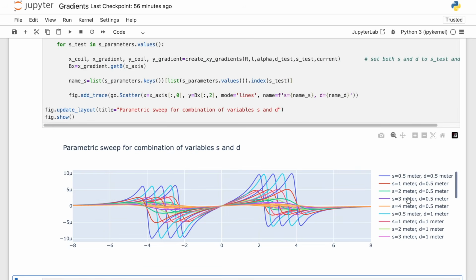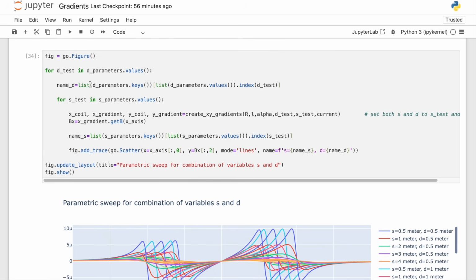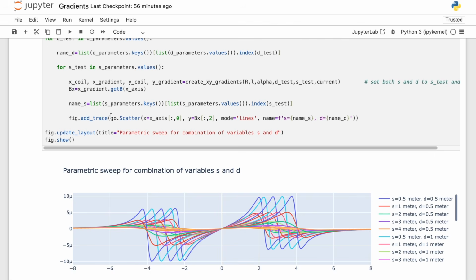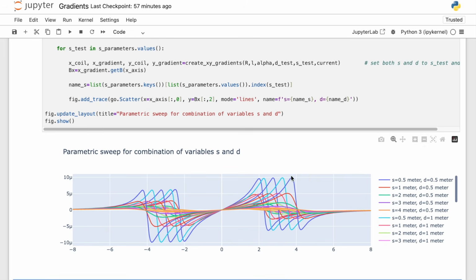Here we see more curves because we have more combinations, and the same logic can be applied for any combination. You can even make more complex nested sweeps. Let's say you can iterate over L, iterate over alpha, iterate over L, R, or all variables. Or you can also make some specific condition. Let's say you can just keep the field which produced the maximum field, or you can just keep the combination which created the most linear field. So many more things can be done here.